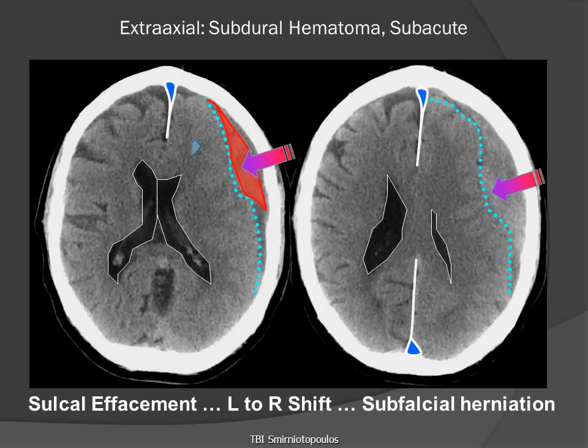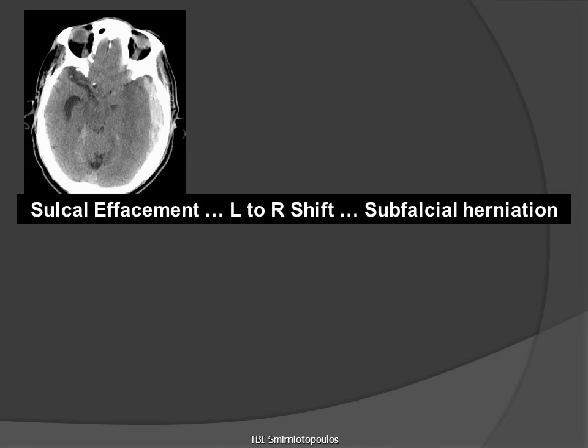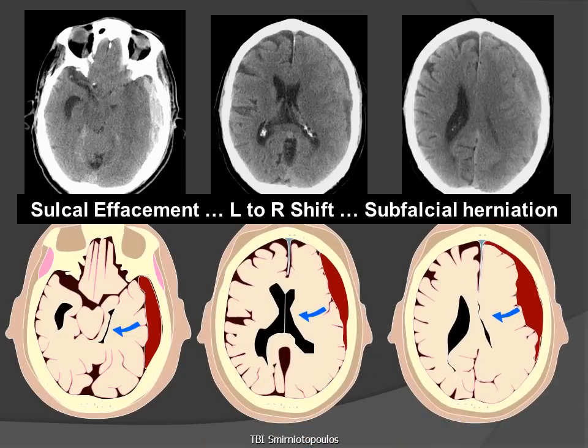When we have subfalcial herniation, the anterior portion of the lateral ventricle and the posterior portion of the lateral ventricle must move medially to pass through the central opening in the falx cerebri. Looking diagrammatically at three sections from the same patient, we can see how: number one, the sulci are effaced; number two, there is a nearly isoattenuating extra-axial collection, except in the lowest section in the middle cranial fossa; and three, there is midline subfalcial herniation.